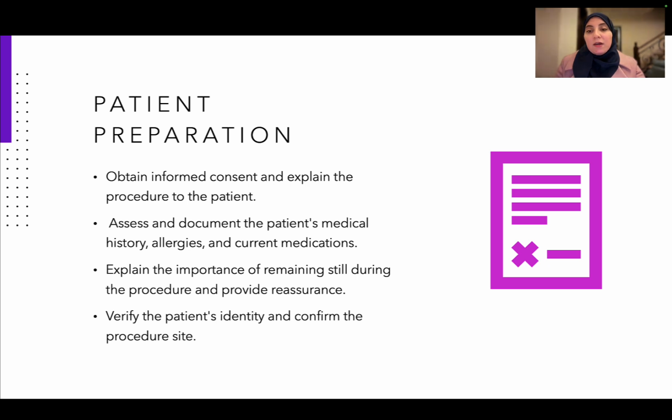And then you explain to the patient, as you have the strongest rapport to the patient, the importance of remaining still during the procedure and to provide reassurance. Sometimes, if there are more than one nurse around the patient, one nurse will usually just try to encourage the patient to remain still, hold their hands. However, sometimes, due to the shortage of the staff, one staff will be helping the doctor and giving support while being on the other side of the patient. And you always need to verify the patient identity and confirm the procedure site.